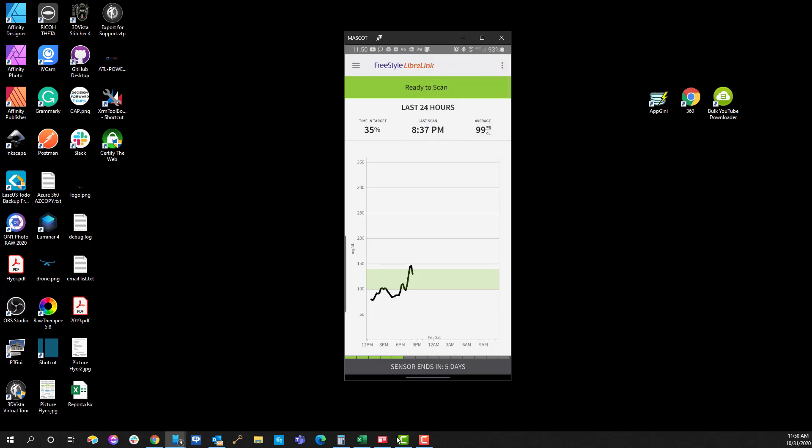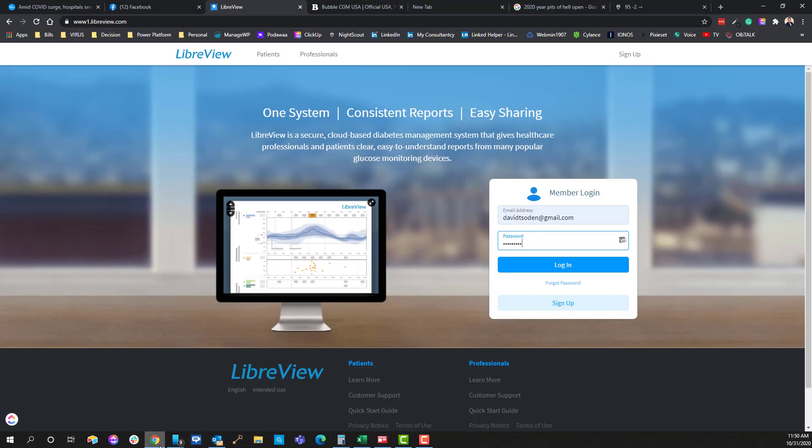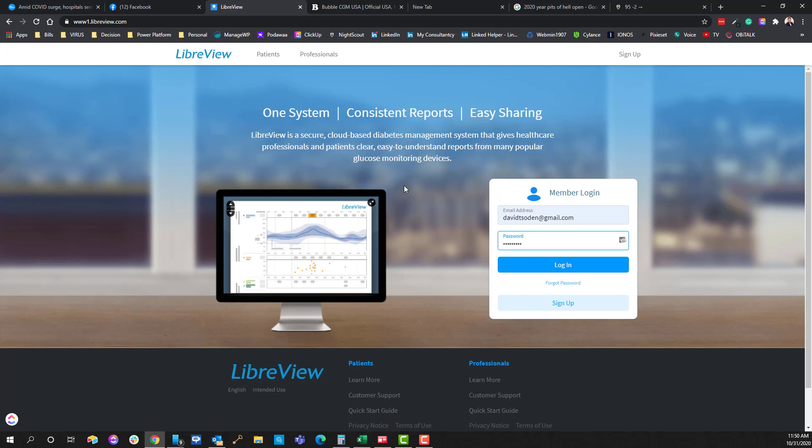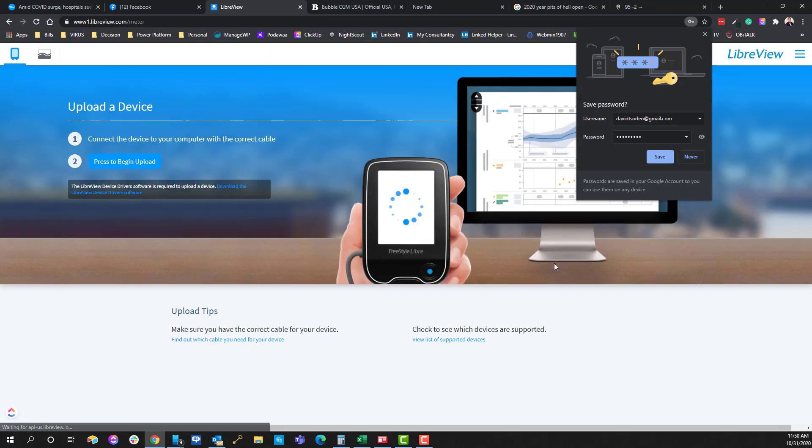That is the same account that you're going to use to log into LibreView. And so since Bubble USA only sells to other people here in the United States, to log into the LibreView, you're going to go to www1.libreview.com and you're going to use the same credentials to log in.